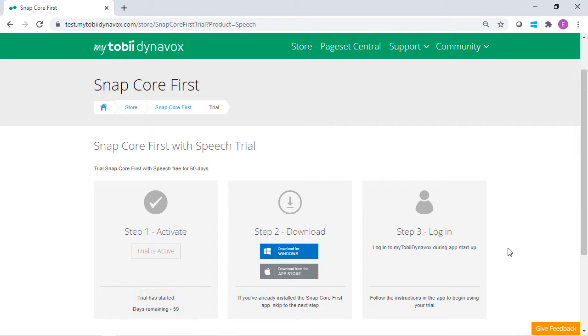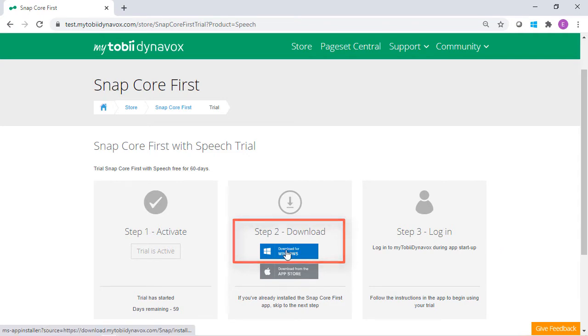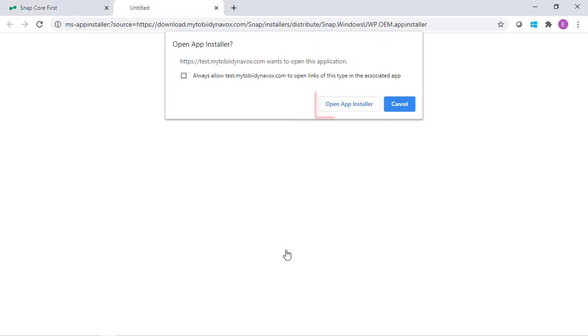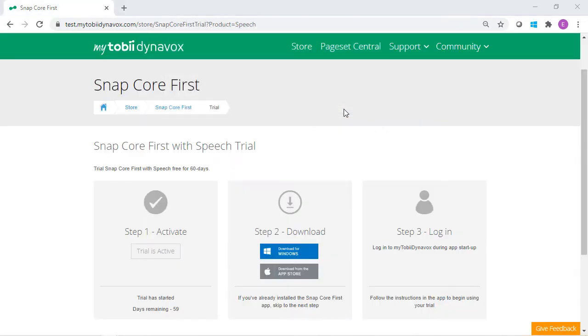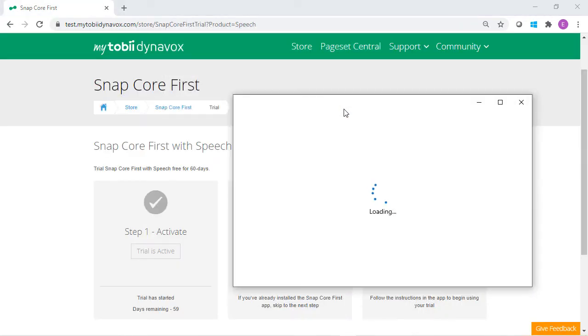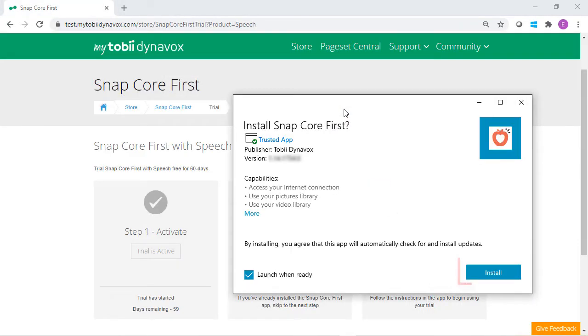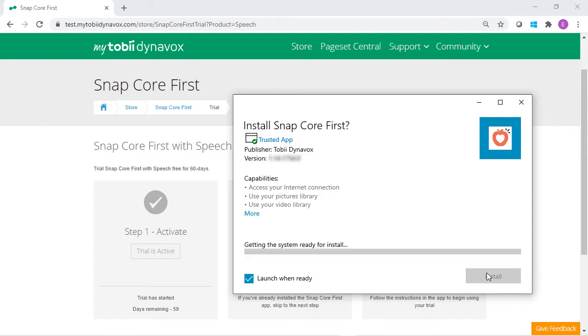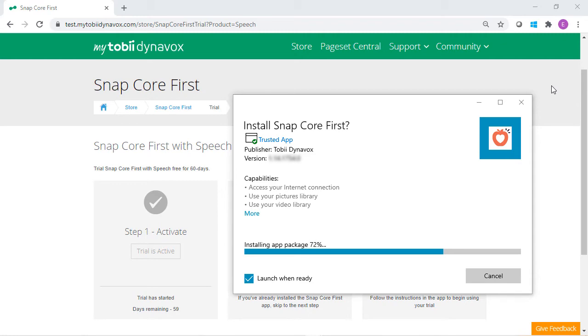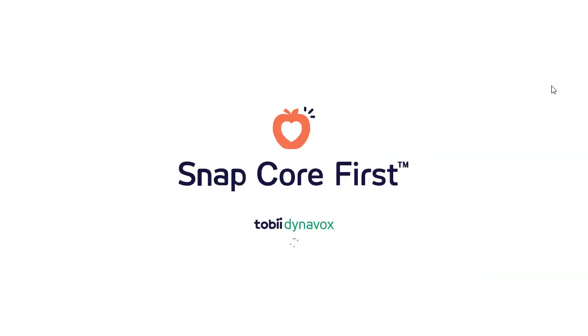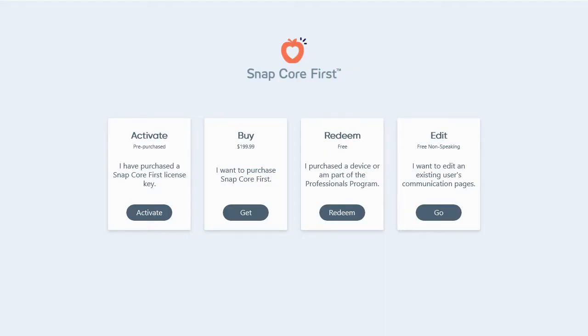Then, using the computer or device, download SNAP Core First. Once downloaded and installed, open SNAP Core First.